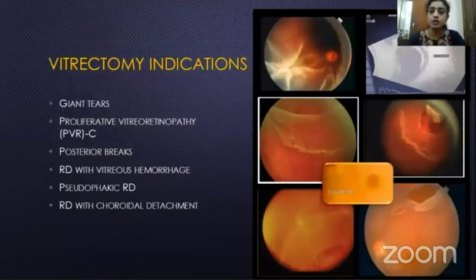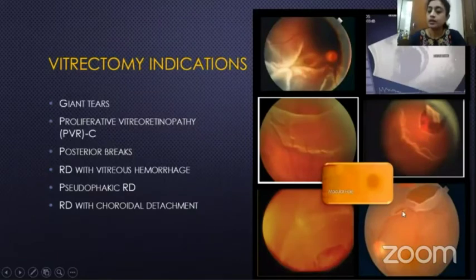Coming to vitrectomy indications, mainly it is giant tears as shown here, or PVR that is dense involving the posterior pole, retinal detachment associated with choroidal detachment, a huge HST with active traction, large inferior breaks, multiple retinal breaks involving the posterior pole, and macular hole associated retinal breaks.